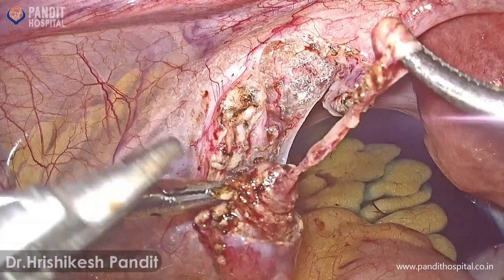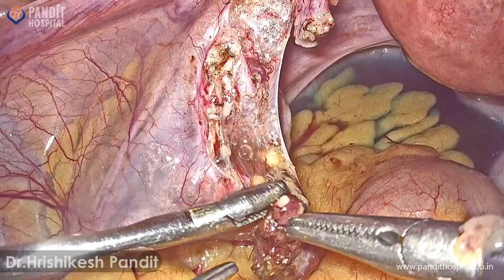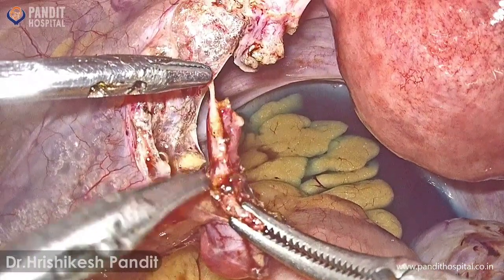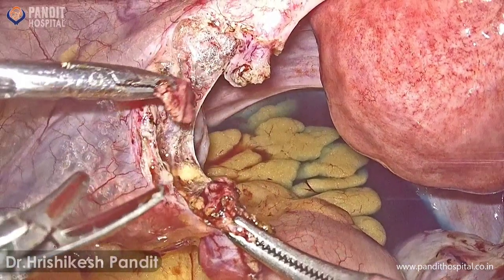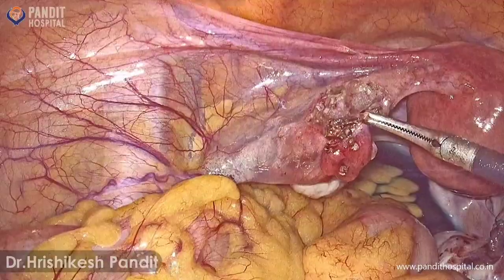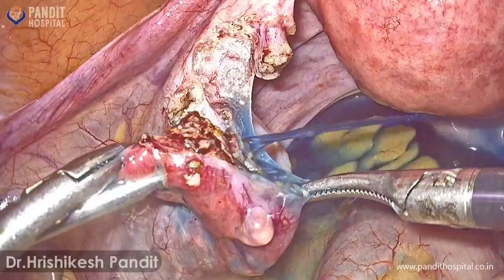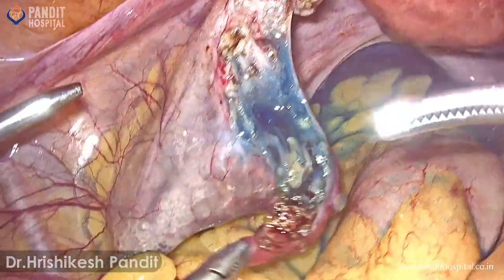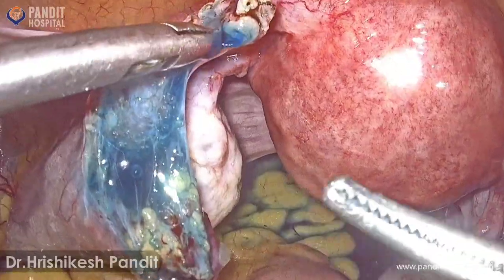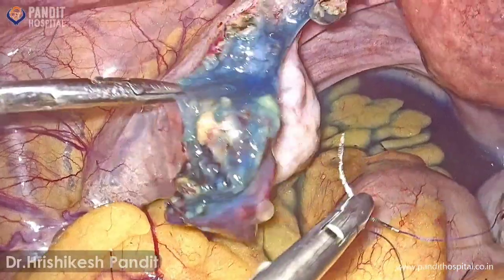Here you can visualize the muscular portion and mucosal portion that we have exposed after puncturing the cyst. Now we are opening the tube and the mucosa using cold scissors — you can see the mucosa of the distal end. It is a really short end on the distal side. Now we are checking the patency again.